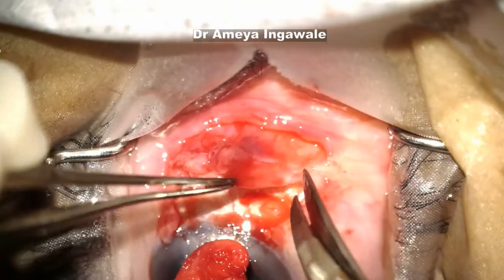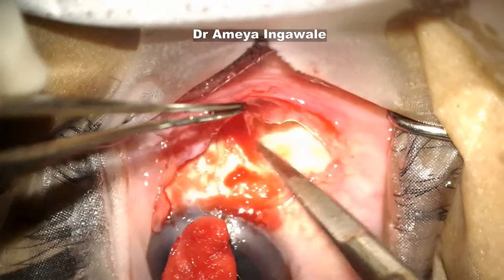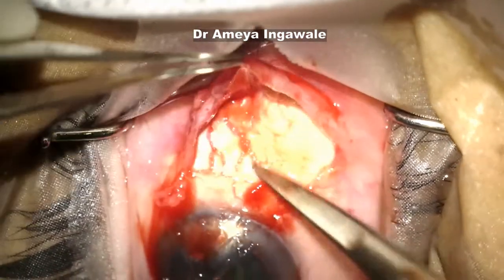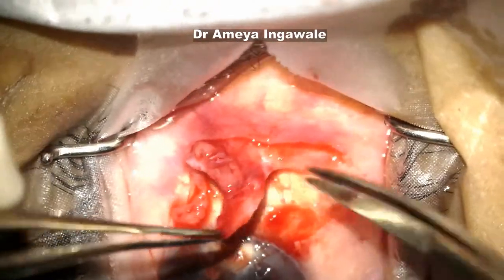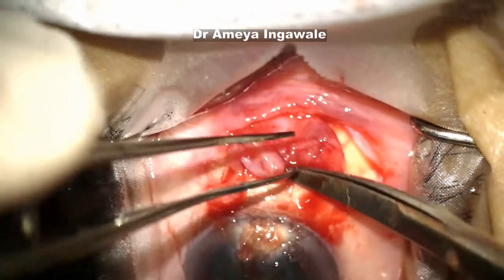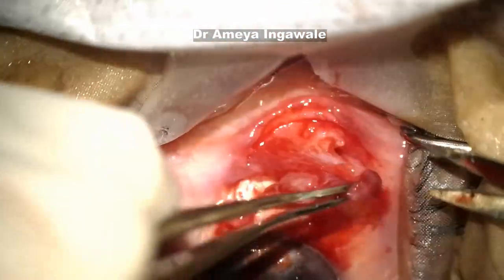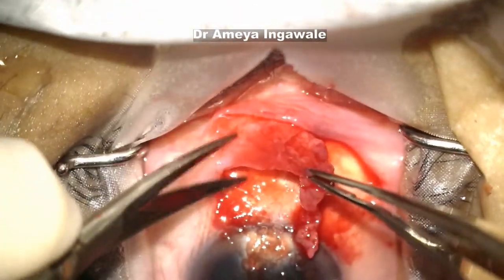Keep avulsing — there are various attachments, remove all of them. The cut of the pterygium has to be made in the white part, which is thick and fibrous. Whereas the proliferative pterygium tissue is pink and softer. So make sure you are in the tough white part and cut there.